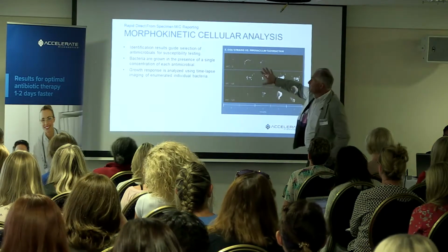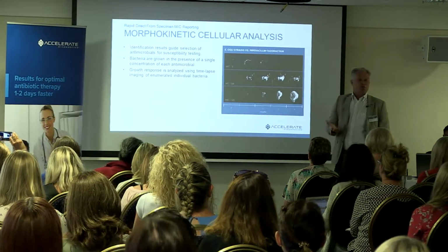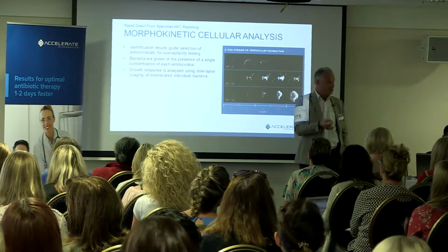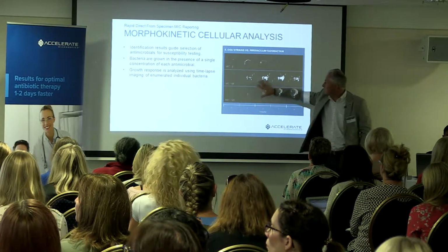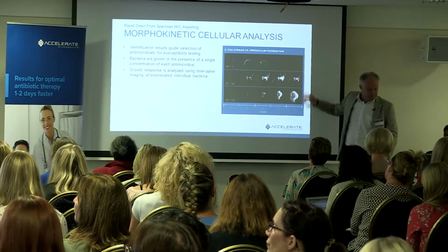So what we do, we follow those bacteria over a period of 4.5 hours. Every 10 minutes, we make an image of every single CFU we find in the sample, and we revisit every single CFU every 10 minutes for 4.5 hours. And you get a kind of video time-lapse image of it.